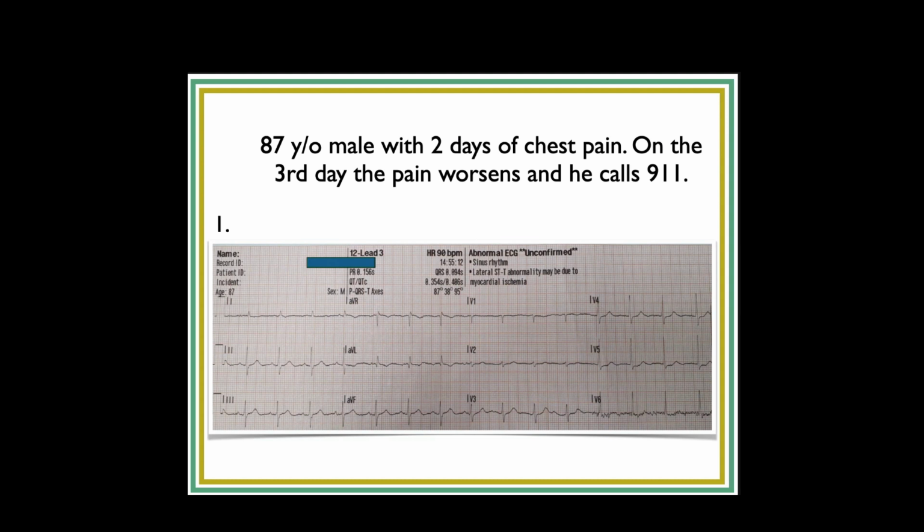So, 87-year-old male with 2 days of chest pain. On the 3rd day, the pain worsens and he calls 911. Check out the time here, okay? So it's 2:55, and there's not much here, and certainly the printout on the computer is not seeing anything else.